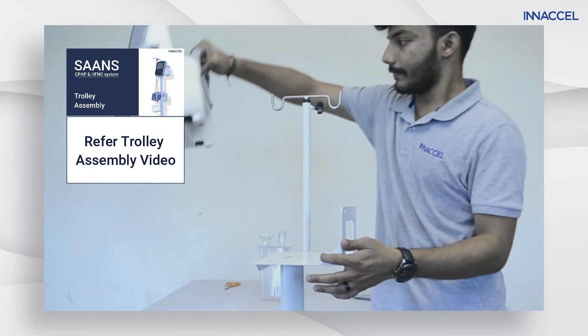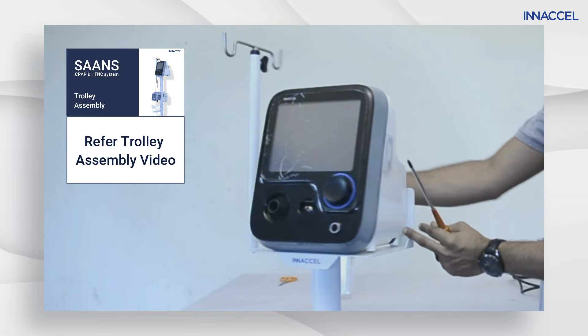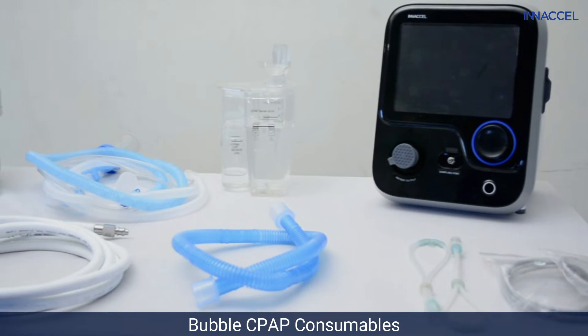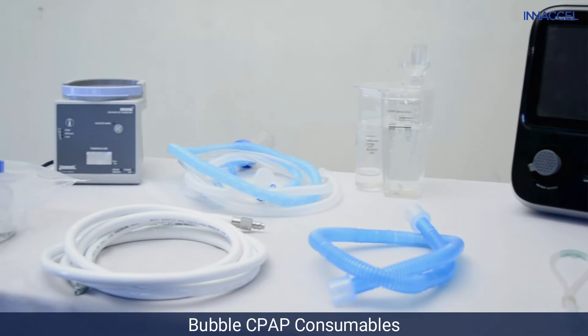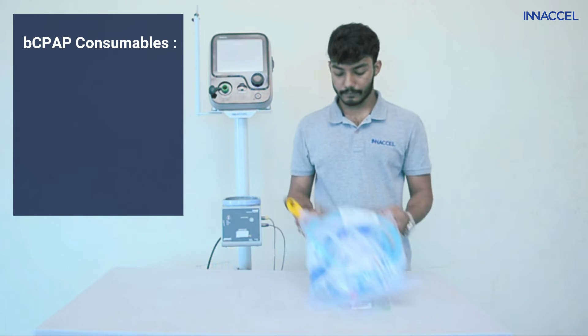First, make sure the SAS device is mounted on a trolley or placed on a stable flat surface, and make sure that all the above mentioned components are easily reachable. Now carefully open the SAS bubble CPAP consumables packet.